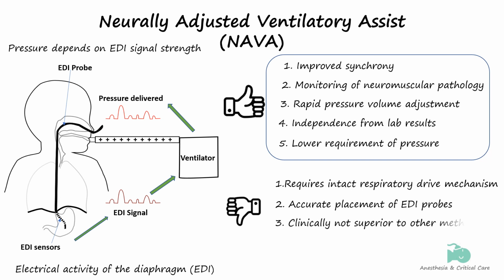Clinical evidence shows no significant improvement in outcomes compared to pressure support ventilation, and it hasn't demonstrated better results in neonates either, though no harm has been reported. Apart from the ventilatory reasons, the catheter and the ventilator are expensive.